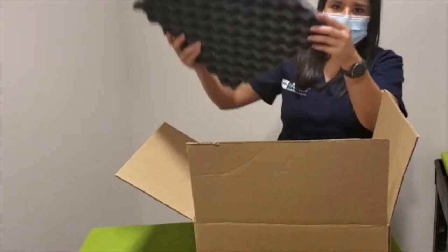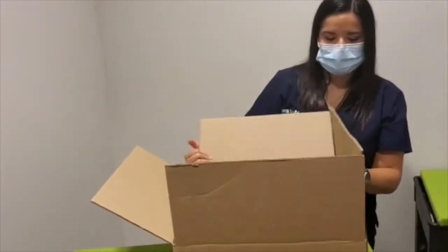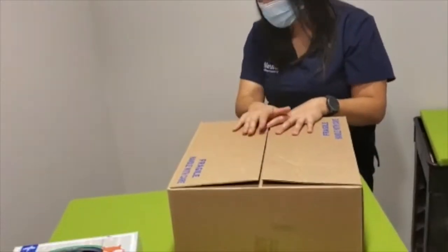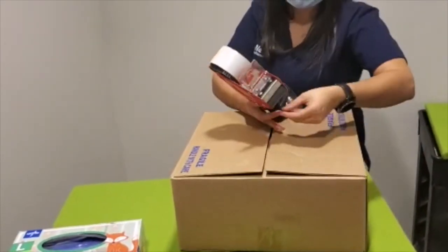I will go ahead and place one more piece of foam with the texture facing down into my box. Remembering my tallies, I will go ahead and seal my box.